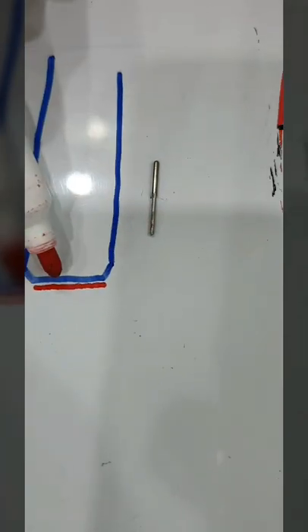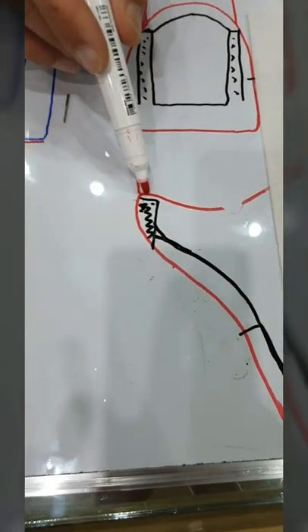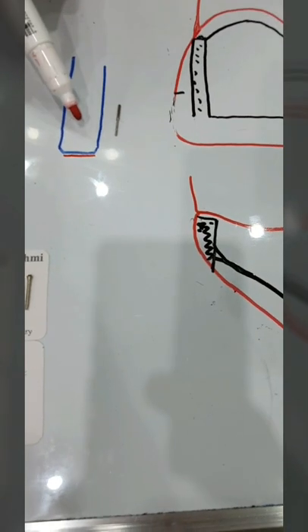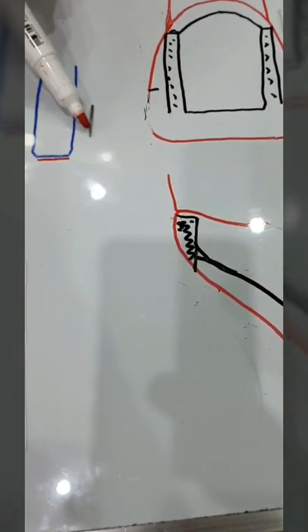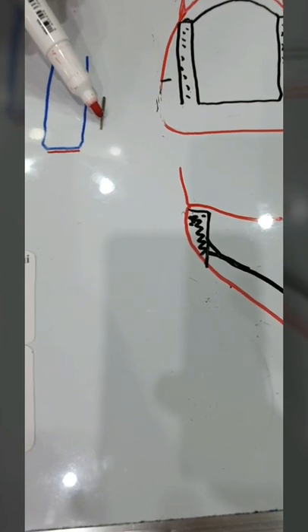I utilize this occasionally to really finely smooth the margin on a preparation, like in this area. So I would be just smoothing this marginal area right here, the bevel itself, the margin all around. I would use this burr and smooth it really nice. Since it does not have any diamond or any cutting edges on the side, it cannot nick the adjacent tooth.